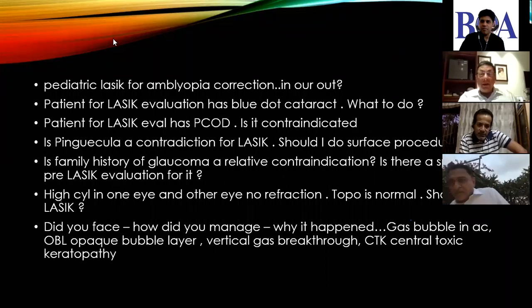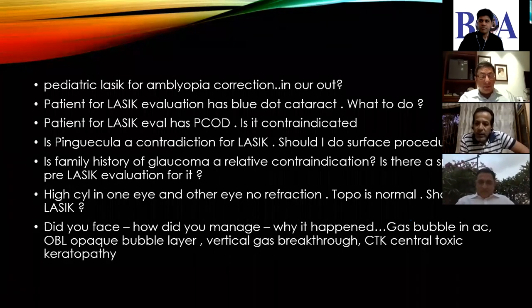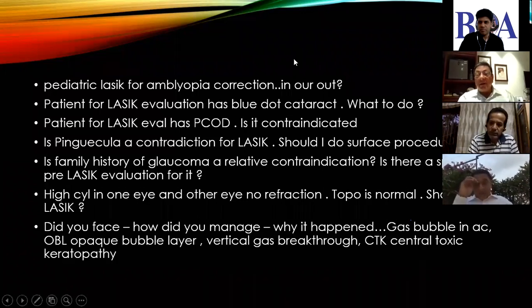Different issue if it's a pterygium, mind you. We can take that also. What to do if it's a pterygium? Then you do a surface ablation, or whatever doesn't involve a suction device. Yeah. Okay, Swapnesh, next.